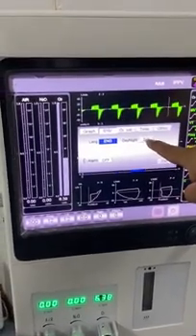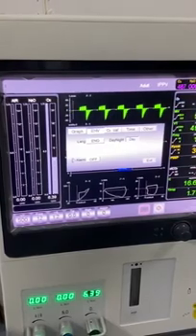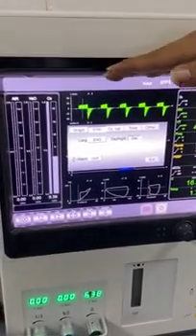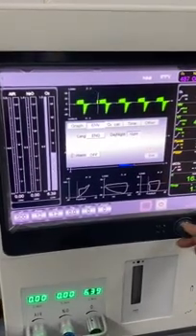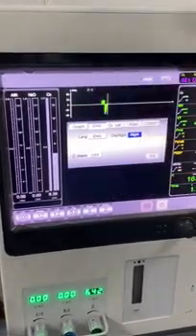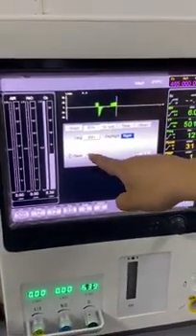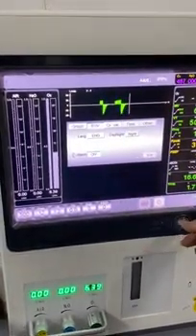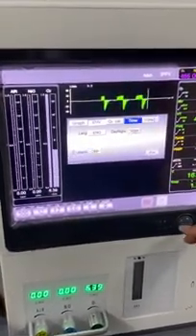And for day and night, because we know in the daytime, maybe the sun shines very brightly, and we want to make the machine screen a little bit down. So then we can make it the daytime, and also we change to the nighttime, so it can protect the doctor's eyes. And here we can also open the alarms for the menu or take it off.